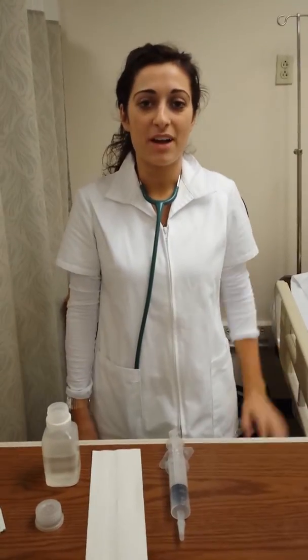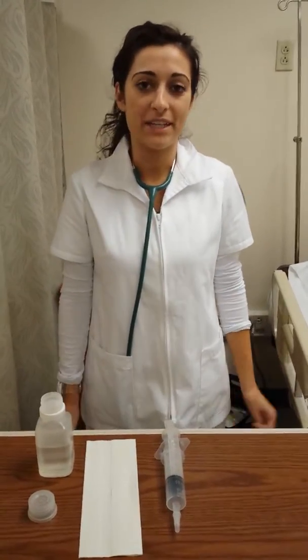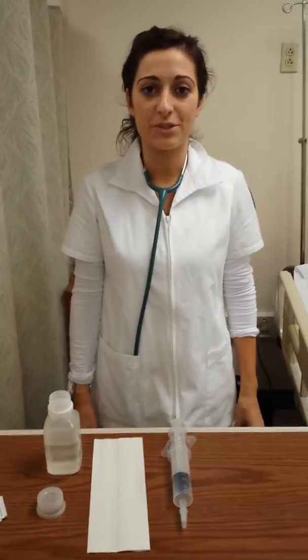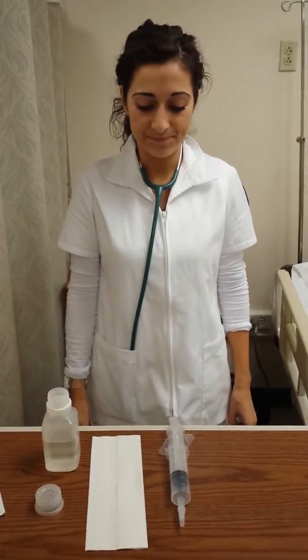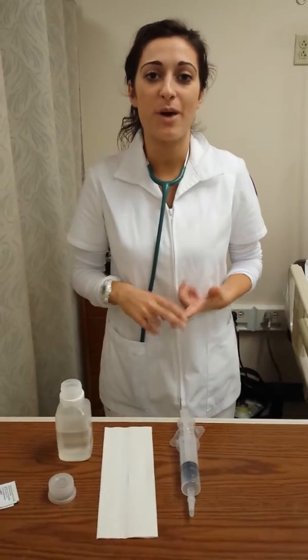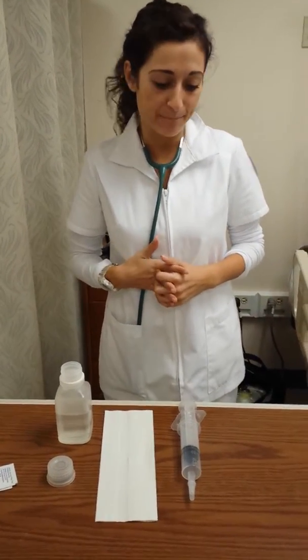Hi, my name is Gabriela Tirana and I will be doing the NG tube for Professor Vados' class. So first I'm going to do my seven steps: check the physician's orders, wash my hands, obtain my equipment, identify the patient, introduce myself to the patient, provide privacy, and explain the procedure to them.